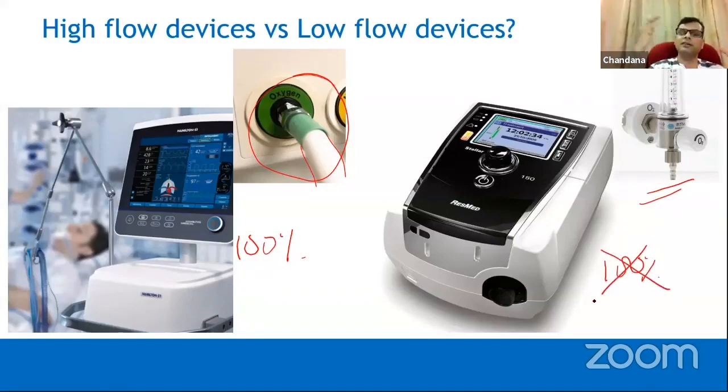Theoretically, they say in a test lung with a lower tidal volume, but still it's extremely difficult. I challenge anybody: with a 15-liter flow meter, delivering 100% oxygen is virtually impossible, because as Dr. Anompera said, you need a peak inspiratory flow rate, which is generally about 30 to 45 liters.